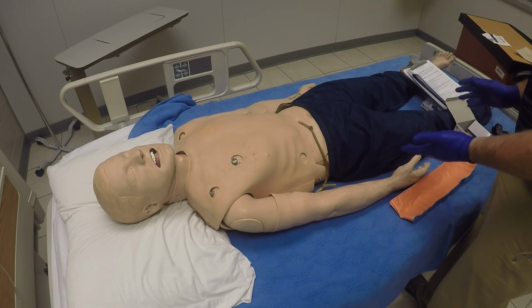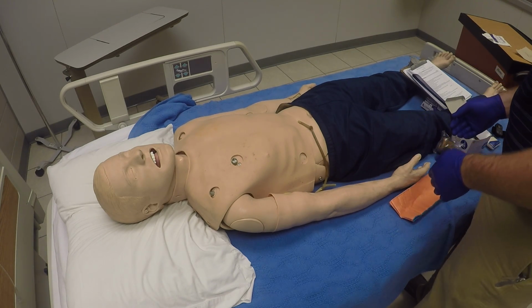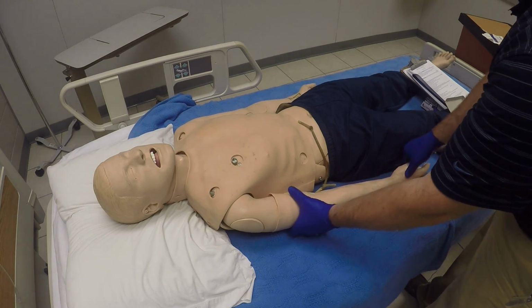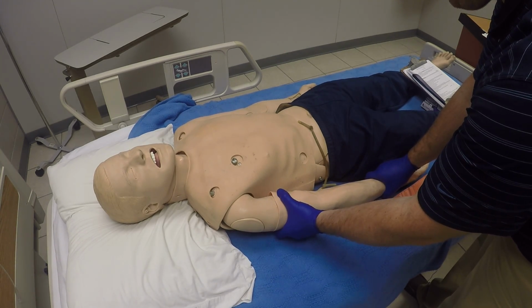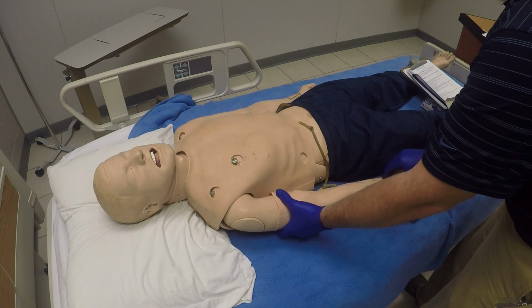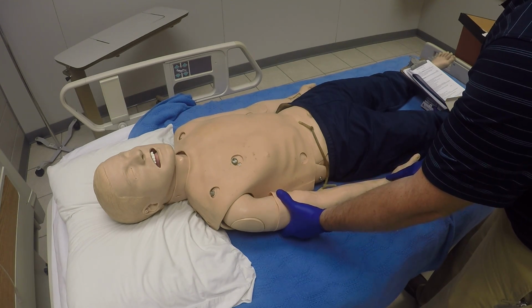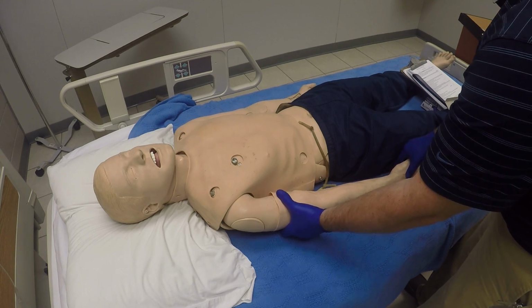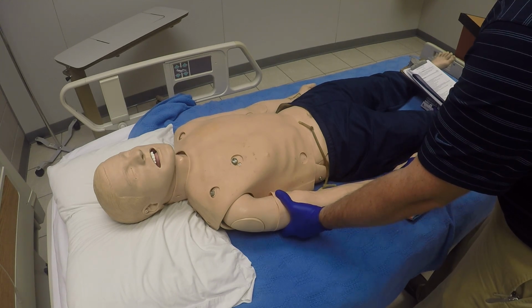First thing we want to do is make sure we have our PPE on. We're going to have a partner. Direct application of manual stabilization of the injury, securing above and below the side of the injury and maintaining that. We're going to go ahead and check that we do have PMS intact. Have them wiggle their fingers and maybe squeeze your hand, and also check for a good pulse there.